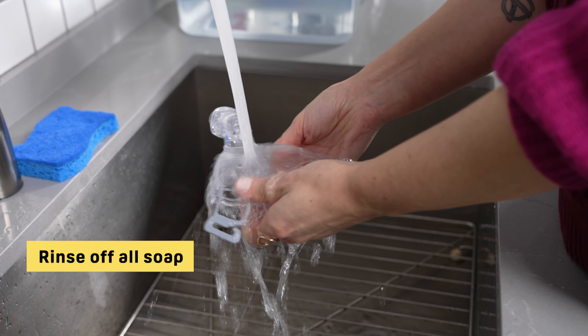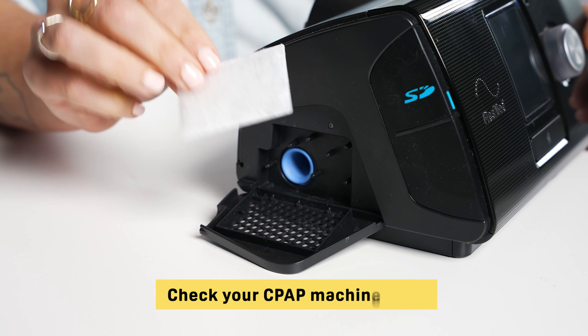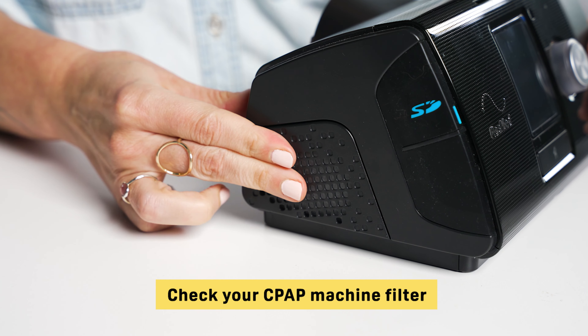Once you've disassembled the pieces, here's how to clean the CPAP tank. Start by rinsing with mild soap and warm water — make sure the soap is unscented and not too harsh, otherwise it can damage or contaminate the tank. Once you're done cleaning the humidifier, rinse the entire tank with cool drinking water and place it on a clean smooth towel to air dry. Make sure the tank is not exposed to direct sunlight while drying. Once a week, give your tank a deeper clean using a one-to-one solution of warm water and white vinegar. Fill the tank with the solution and leave it to soak for about 15 minutes, then pour out the solution and allow the tank to air dry on a clean towel.